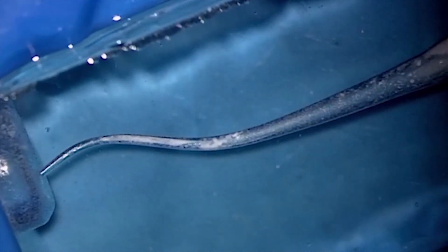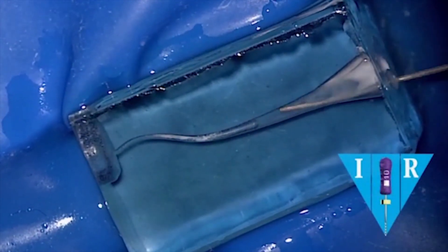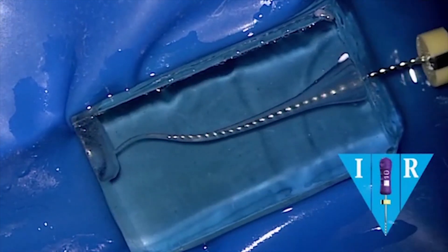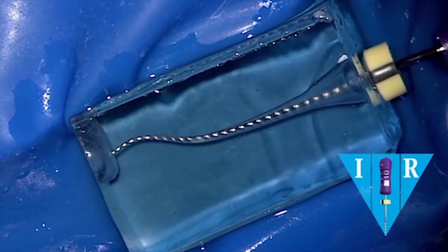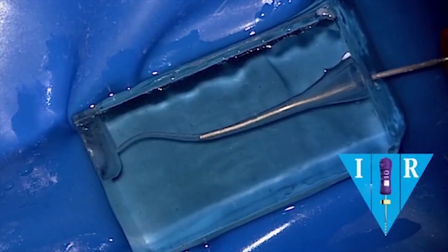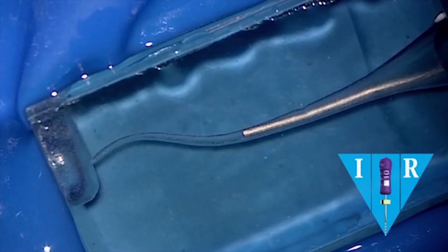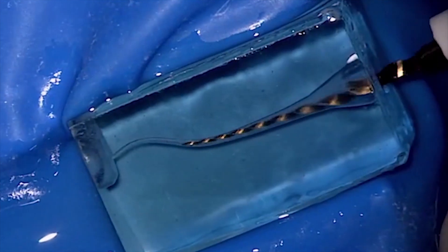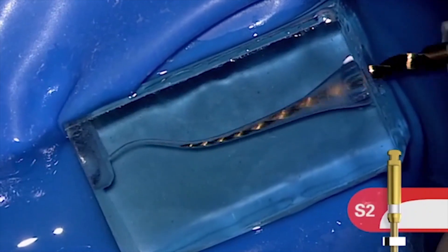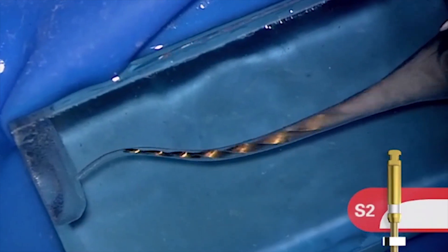A lot of colleagues skip these little steps and that's how we get into trouble. We can recapitulate with either the 10 file or even use the more flexible ProGlider to just clear the canal, break up debris, and move it into solution so that we can re-irrigate. You can bump these solutions and notice we're moving solutions much deeper than the placement of the cannula. Here comes the S2. It'll carry a shaping wave progressively deeper into the canal and it'll work primarily in the middle one third.